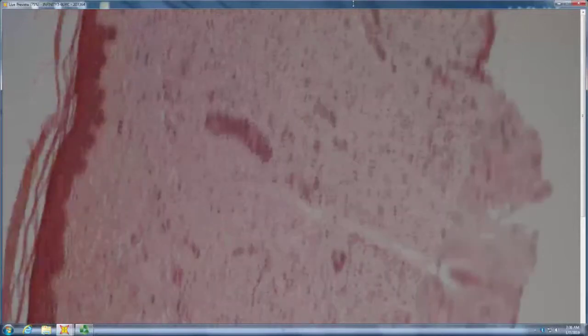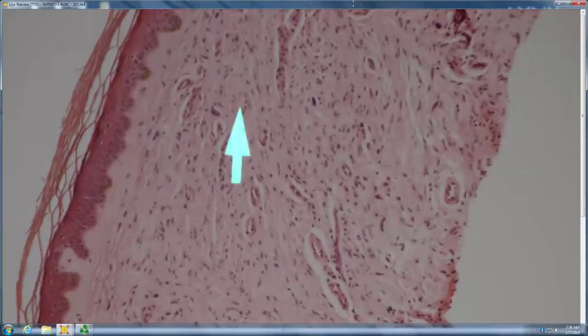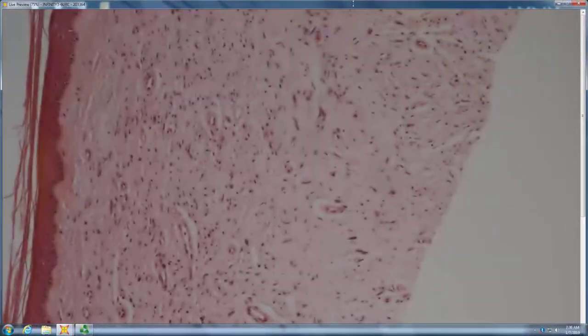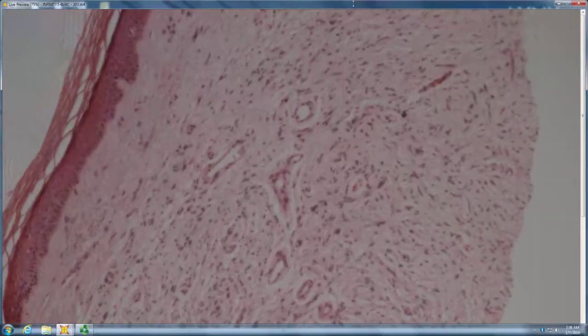Oh, myxoid. It's a little myxoid. Some of the cells are wavy, thinking like a neurofibroma. Yeah, like a neurofibroma, but then you have pleomorphism. You have bigger, darker ones, right? So then this is a malignant neurofibroma? Not just that alone.